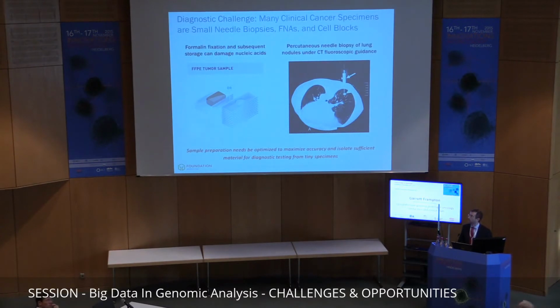Another real challenge with cancer diagnostics is that the tissue that's available can be very small. The way that it's prepared, formalin fixed and paraffin embedded, can degrade DNA and prove challenging for molecular diagnostics. So any sort of sample prep or diagnostic methodology has to work in this setting to be useful clinically. For research uses, you can pick and choose the samples that you use, but for a clinical diagnostic, you need to get a successful test on all the material that's available.